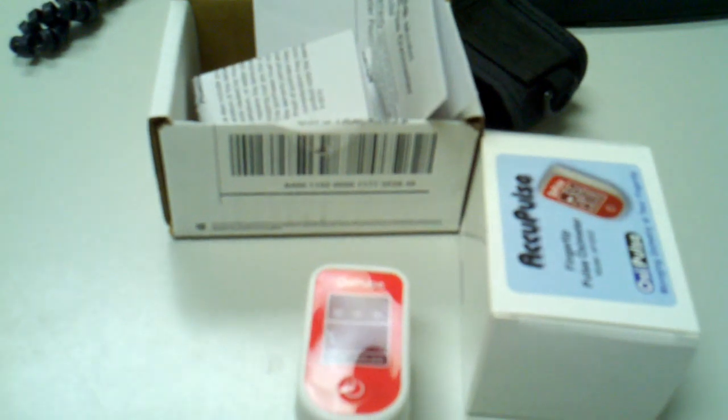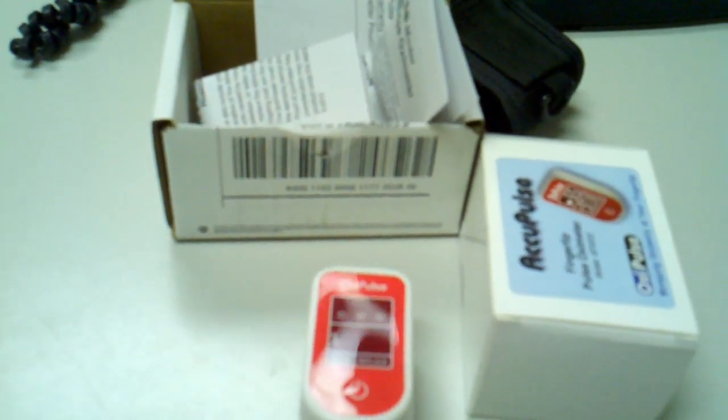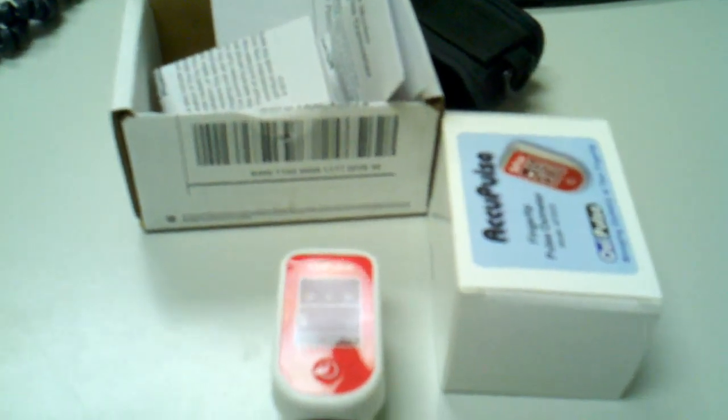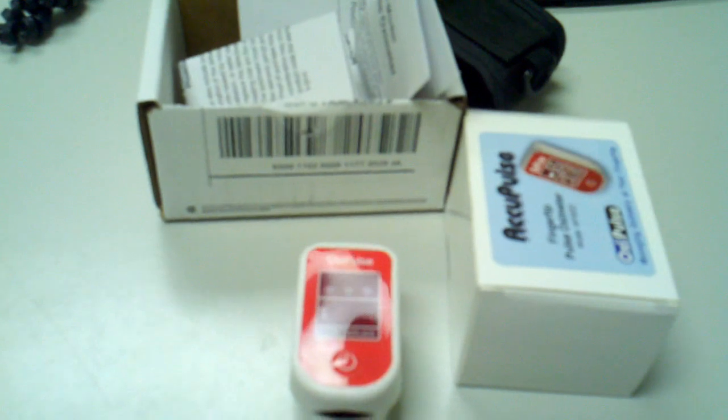Hello, today I'll be discussing how a pulse oximeter works and what you get when you order a pulse oximeter.